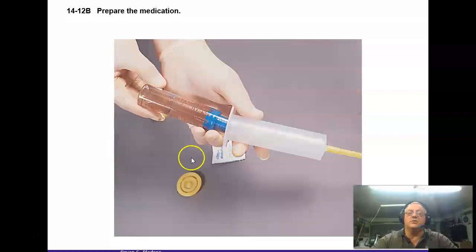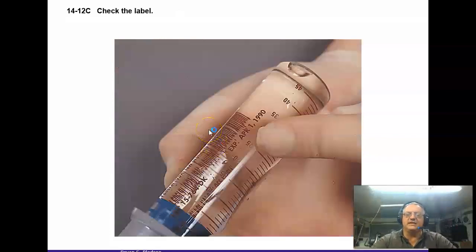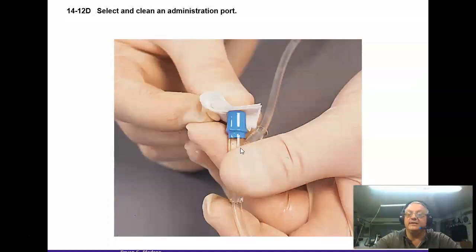Usually what happens is we'll pull the two safety caps off, and these two pieces screw together, and you'll get a little bit of fluid out of the top of the needle once you screw these together. Make sure that you get the air out. Also, double check your expiration date, please. Nothing like giving it. By the way, knowingly administering an expired med in the state of Florida is a felony. So keep that in mind.